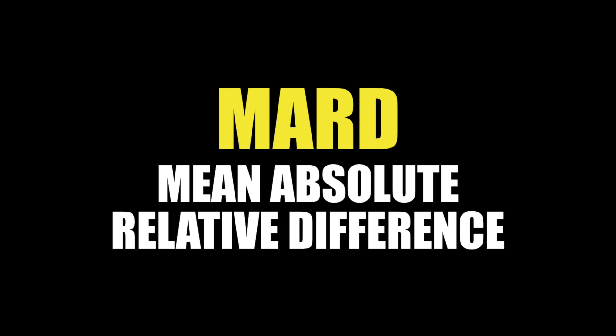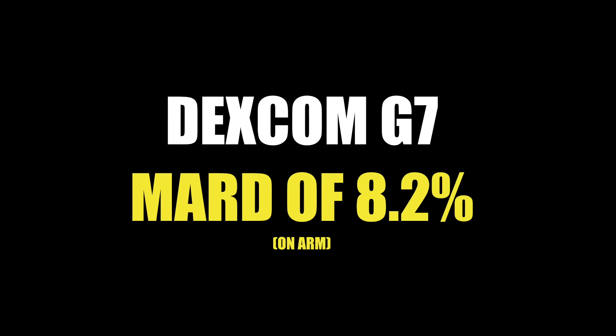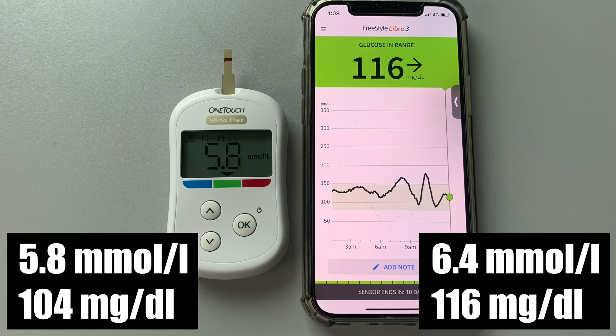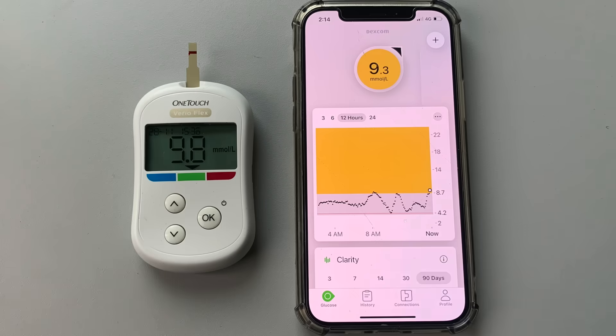Difference number five is accuracy. To compare using a scientific approach, we need to look at clinical studies performed on large groups of users. The common benchmark is MARD — Mean Absolute Relative Difference. The lower the MARD, the more accurate the CGM. Freestyle Libre 3 has a MARD of 7.9% and Dexcom G7 has a MARD of 8.2%, so Libre 3 is statistically a tiny bit more accurate. But based on my experience, both Libre 3 and Dexcom G7 have excellent accuracy — I can't really say that one is more accurate than the other. Keep in mind this is just an anecdotal real-life experience of one user.